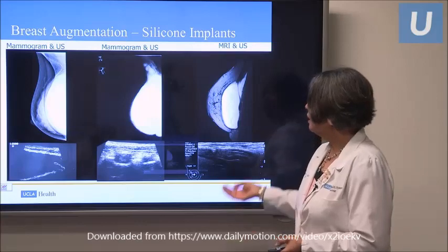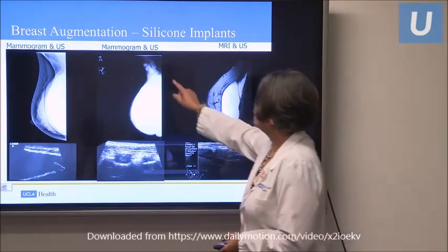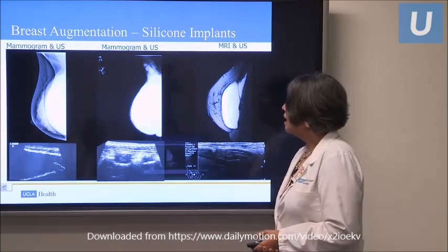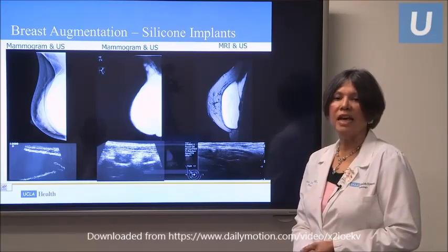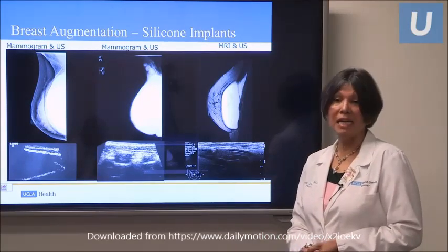This woman, you didn't necessarily need to have an ultrasound to determine that these white circles here are actually free silicone. Now, just to let you know, this is a very old image of what we would call free silicone, because many of the implants are now made out of materials that would not have that type of oozing effect that happened in these earlier implants in the 90s.